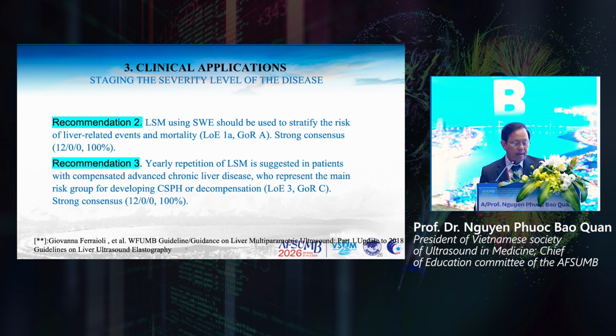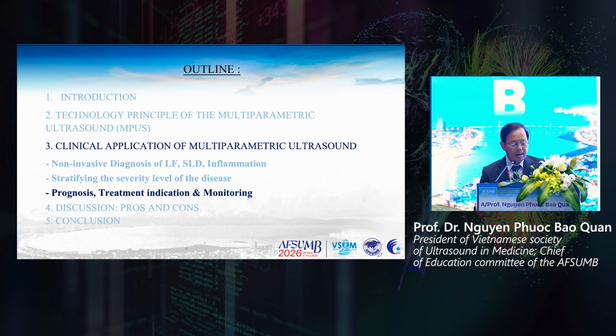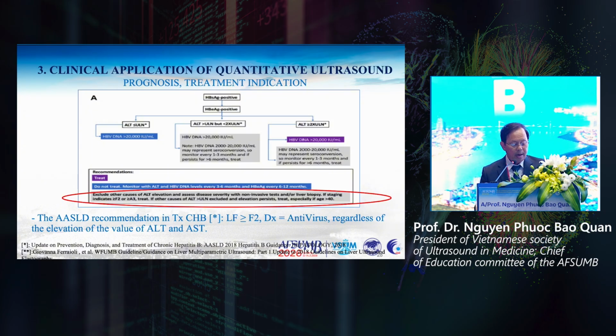And in the guideline of the WFUMB, we have to take a series to measure the liver stiffness to follow up this patient in the case of chronic liver disease. And we move to another application that helps with prognosis and helps to give indication of the treatment and monitoring as well.